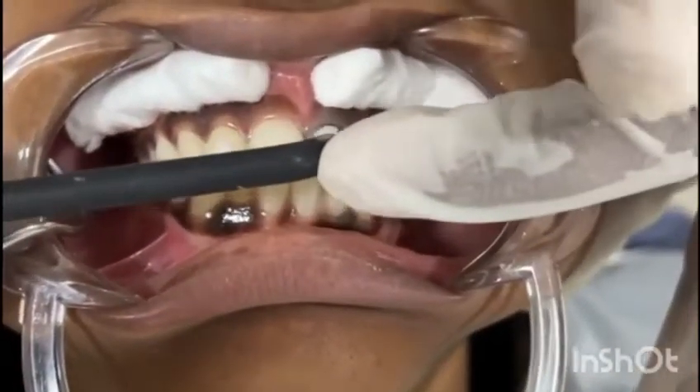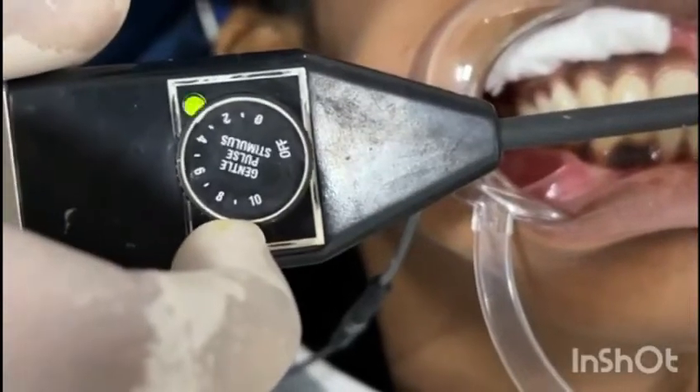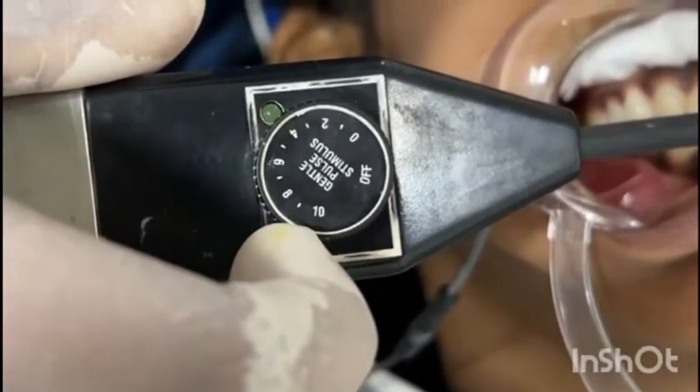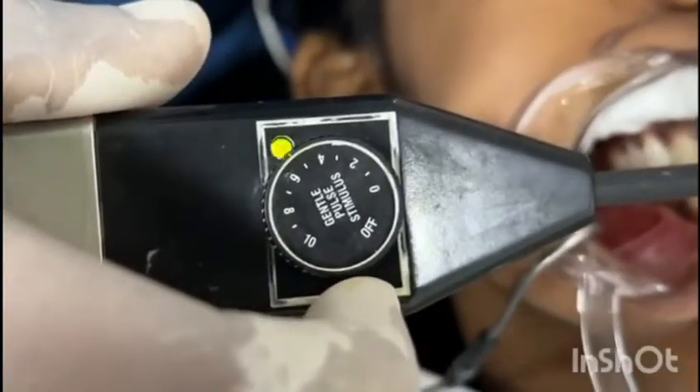If the patient feels any tingling or sensation, then we have to ask the patient to raise his or her hand immediately, and the test has to be stopped.